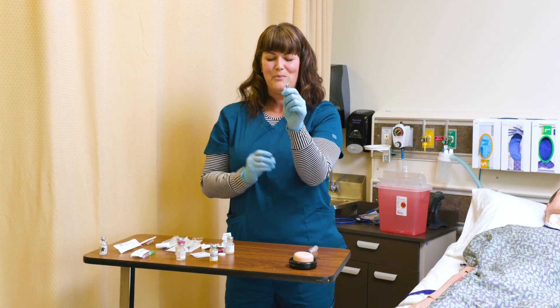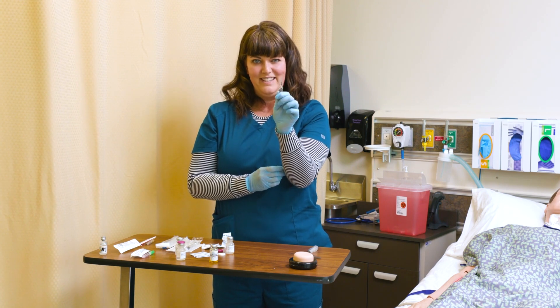Many, many nurses have cut their fingers on ampoules before they had breakers. Be careful with these.